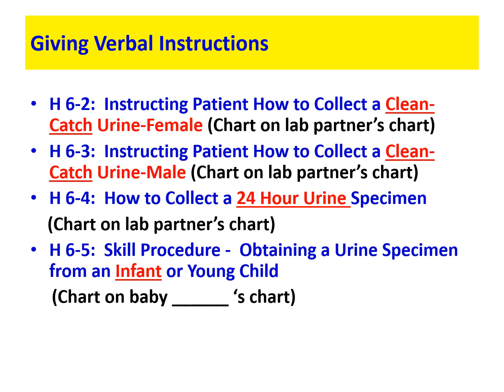Now, guys, remember, you will be collecting a clean catch urine at home and bringing it in with you Wednesday to class. So make sure that you're taking care of everything that's on page 73 and 74. Read through it, make sure you understand it, and click it off. Being able to give correct instructions to your female patients on how to collect a clean catch urine is vitally important, and you will be tested on it. And make sure that you're charting it on Jane Doe's chart.